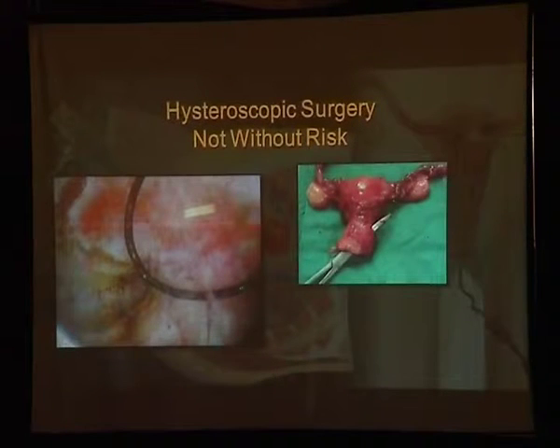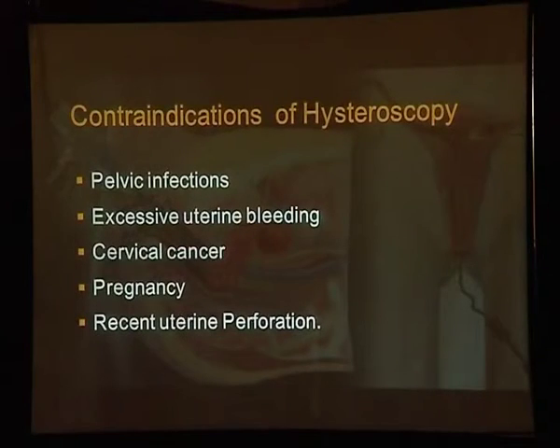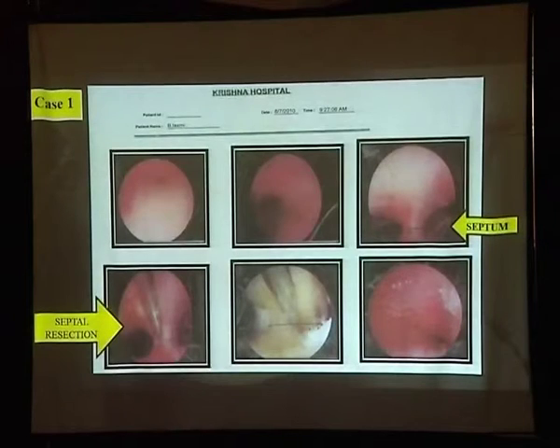Hysteroscopic surgery is not without risk. Any surgery has risk, so be more careful while doing hysteroscopic surgery. It may injure the uterus, bowel, anything. Contraindications are pelvic infection, uterine bleeding, cervical cancer, pregnancy, and recent uterine perforation; hysteroscopy should not be done. These case reports were done.